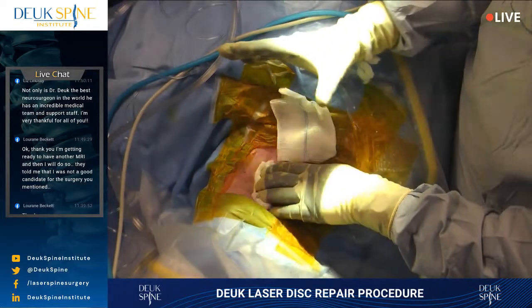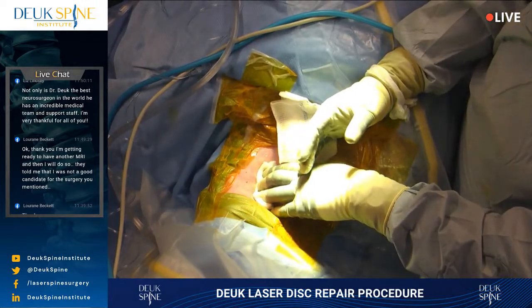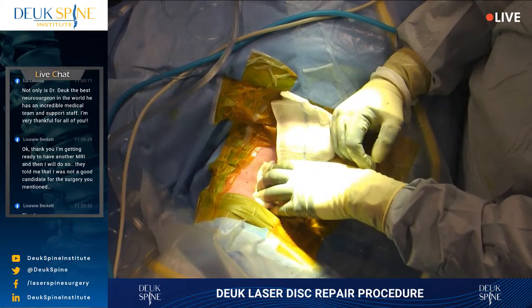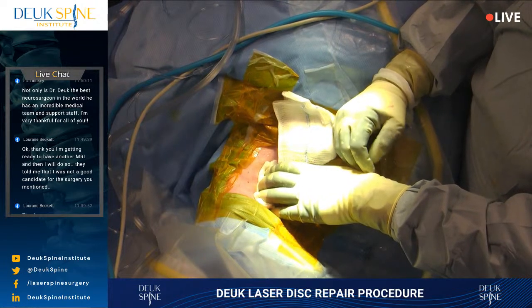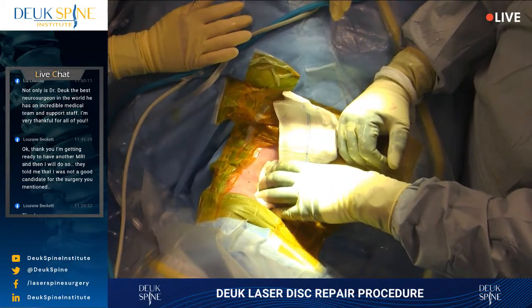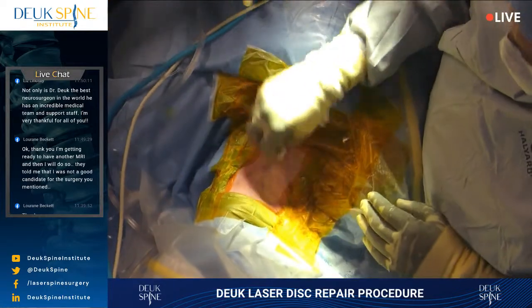So it doesn't matter if it's a herniation or a bulge. It doesn't matter if it's degenerated, stenosis, spondylosis. We can fix it with this laser surgery. I think he's going to be very happy with the results. I think his headaches will be gone, his arm symptoms will be gone, and his neck pain will be gone. Now, he may have a little bit of pain today, but by tomorrow when he comes to clinic, I think all those symptoms will be gone.